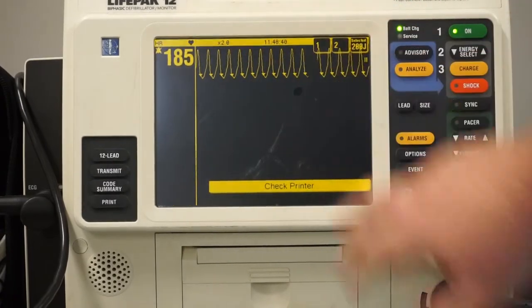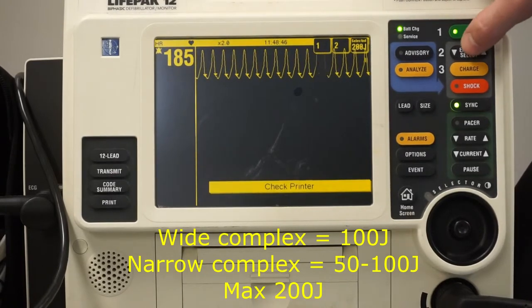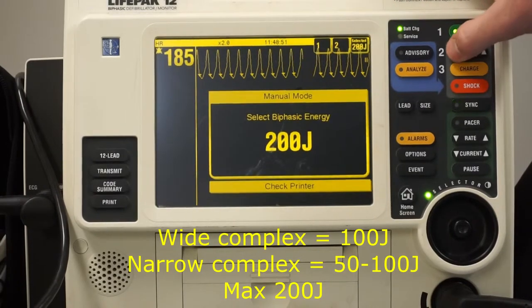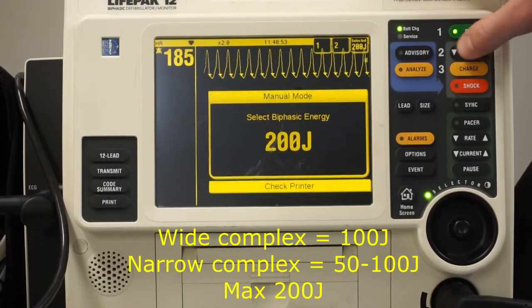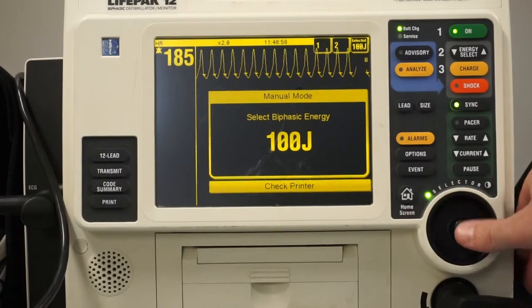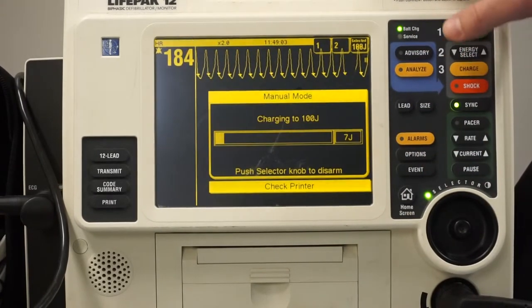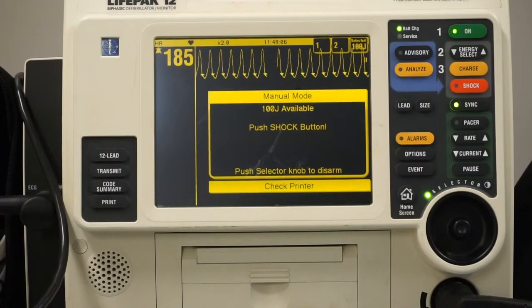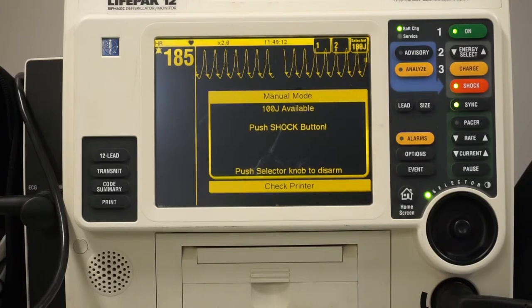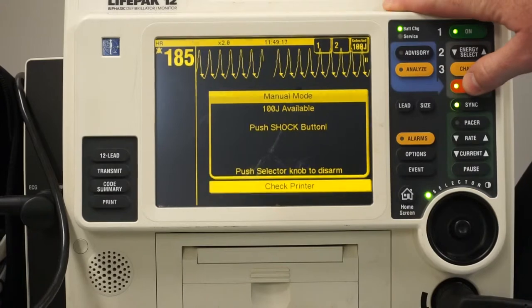With the patient on sync and pads applied, for wide complex tachycardia we start at 100 joules. Go to energy select, toggle or use the wheel to select 100, then charge it up. Once charged, make sure nobody is touching the patient — head clear, feet clear, everyone clear — put your finger over the shock button and deliver the shock.